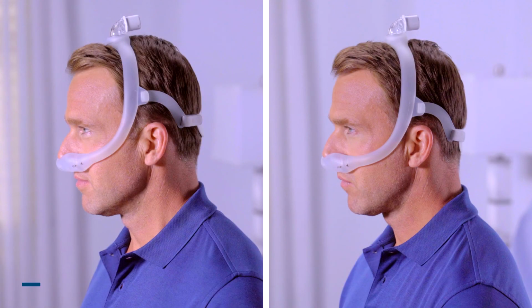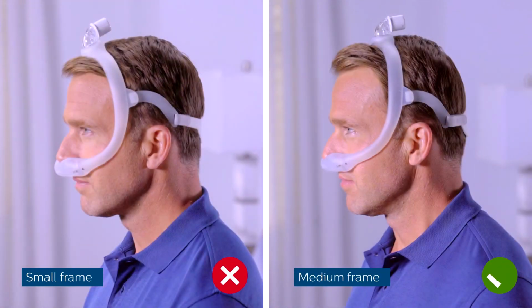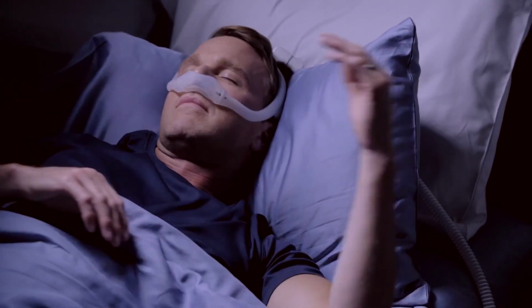Notice how a properly fit medium frame compares to one that is too large. If the mask frame falls forward and is too close to your eyes, you may need a larger mask frame. You can see the difference in fit between a well-fit frame compared to one that is too small. Selecting the correct size frame and cushion will help you enjoy the freedom and comfort of DreamWear.